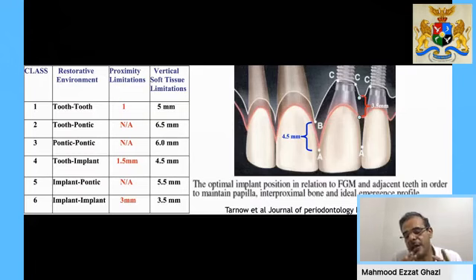Okay. This is the most integral part. The next step is the most integral part for me. Yes, I've planned for the aesthetic proposal, the mastication and the function. Now, what would differ for me, and the main factor that would show me where my implant positions would be, is the type of prosthesis that I'm going to be able to use with this patient.